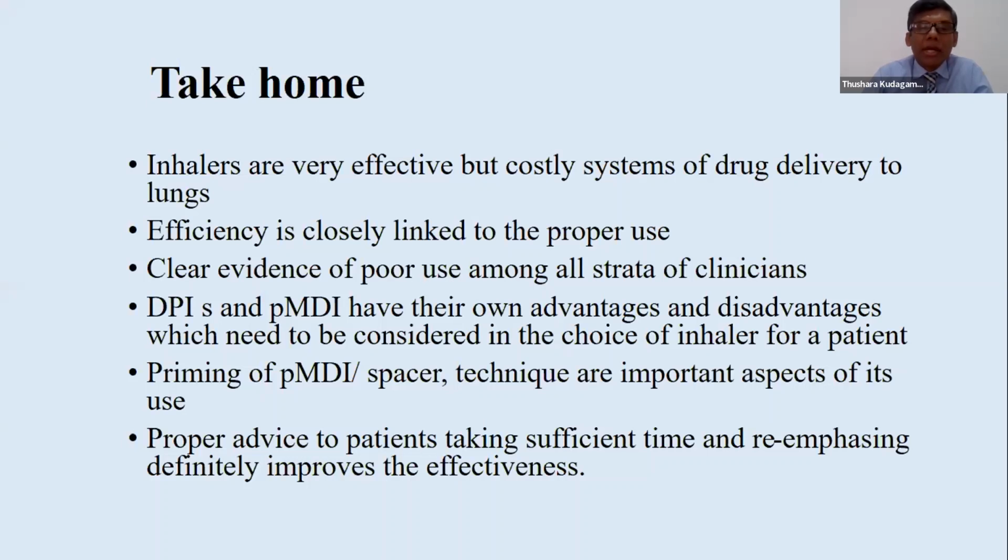Priming of the MDI and the spacer, and the technique, are very important aspects of its use. And proper advice to patients, taking sufficient time and emphasizing and re-emphasizing, definitely improves the effectiveness of this medication. So with that, I'll wrap up.